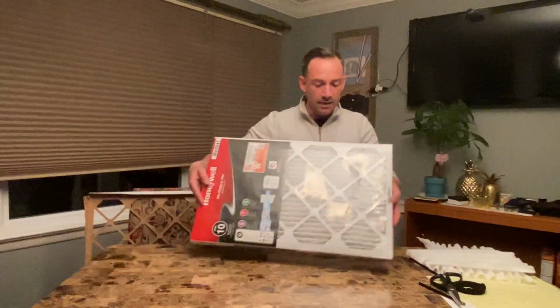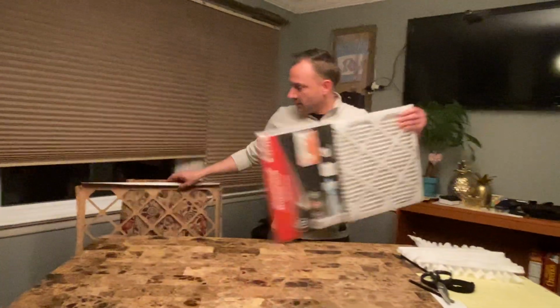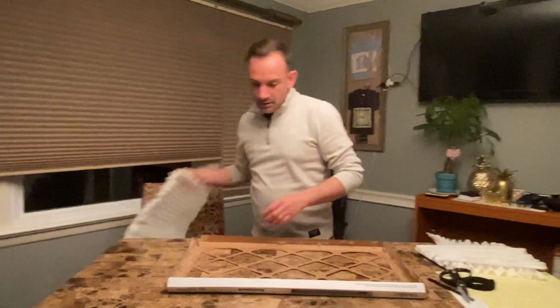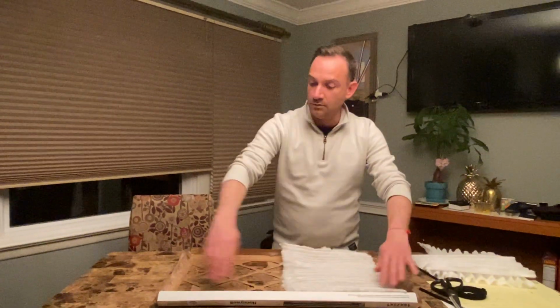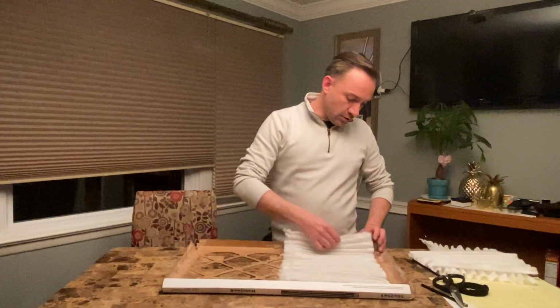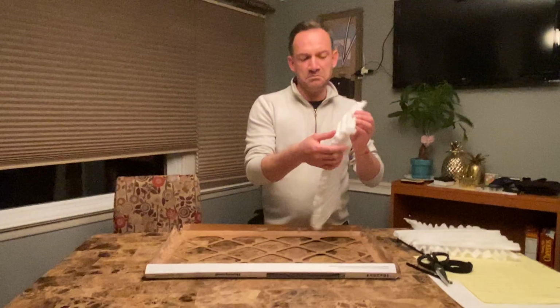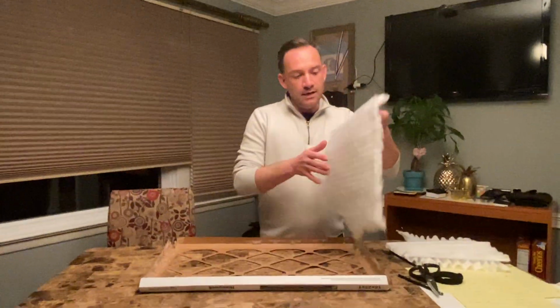So you take the plastic all out of the filter, and as you see, it has a frame. You take out the frame. It's very easy to take. There's just glue on the border. You take them out slowly. Be careful with the wire. Just use gloves if you need to.